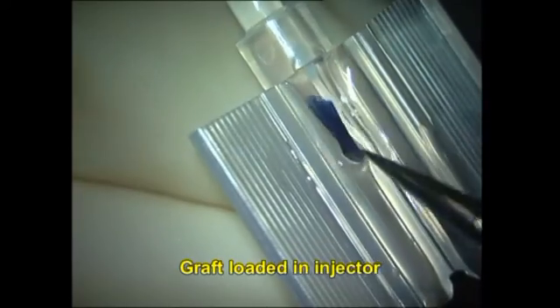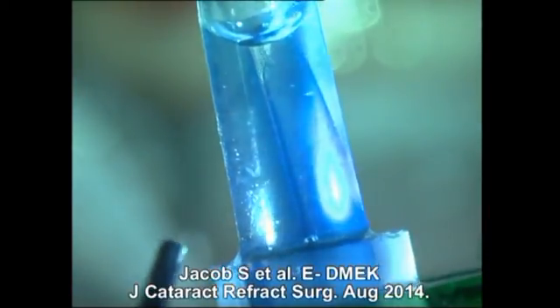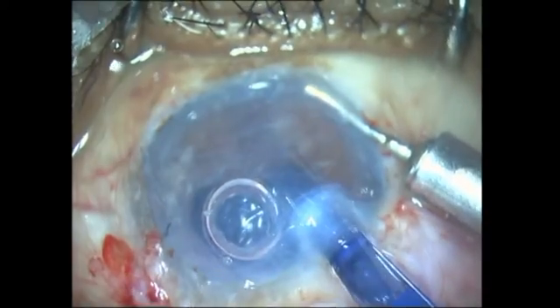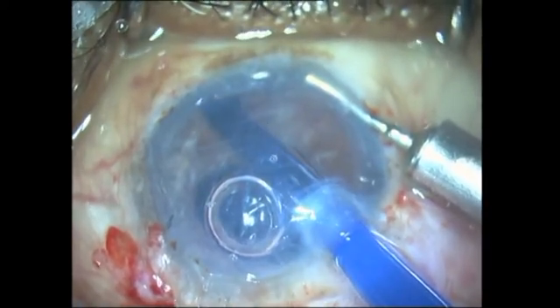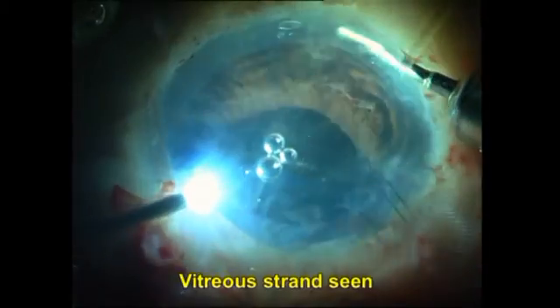The air also prevents ooze of blood into the anterior chamber from the peripheral neovascularization often seen in these patients. I have loaded the graft into the injector and am using my E-DMEK technique — endoilluminator-assisted DMEK technique — to verify that the graft is in the correct orientation even before injecting it into the anterior chamber. Once injected, I quickly suture the incision shut.